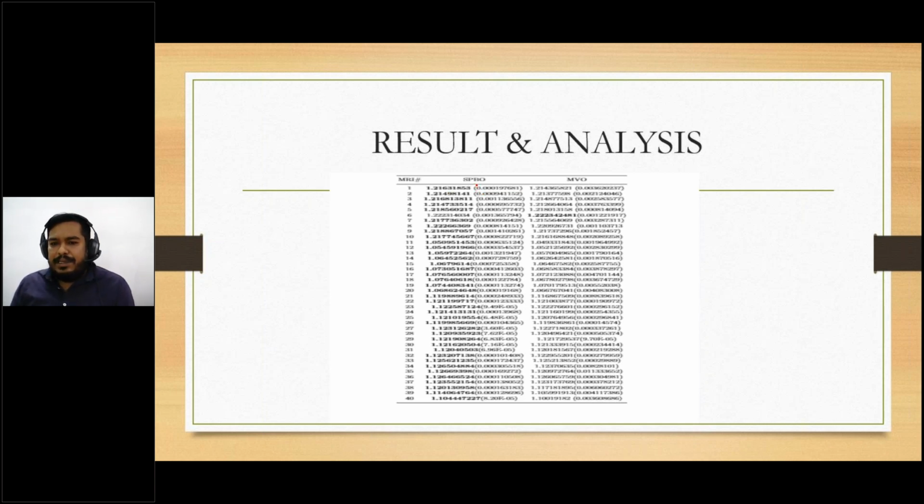Here you can see that the boldface digits denote the mean that I have obtained after registering the image with the SPBO algorithm, and the numeric value enclosed in brackets is the standard deviation that I have computed after registering it with the SPBO algorithm.